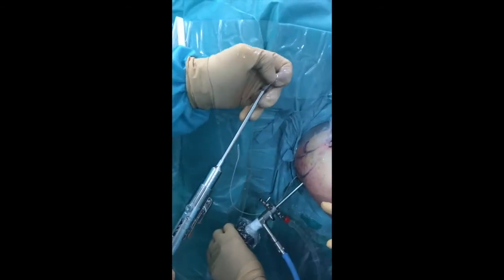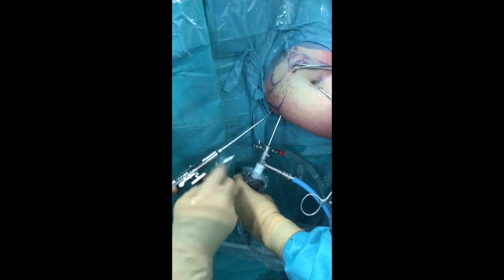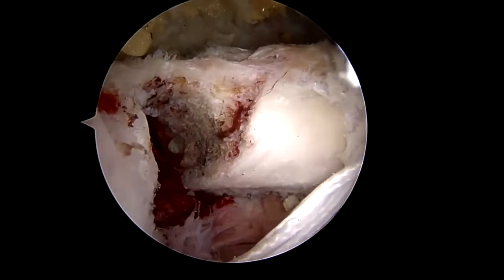With the button tensioner device loaded and the arthroscope placed in the posterior portal, the bone-link is progressively tensioned under direct vision. Here the coracoid process can be seen being transferred in immediately.